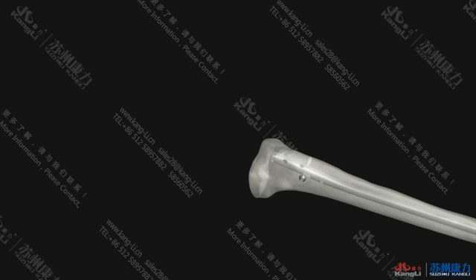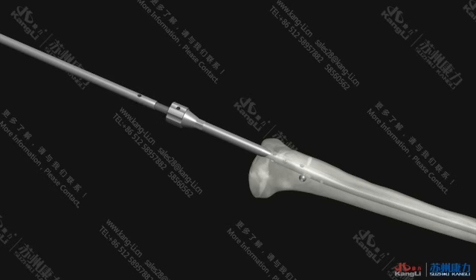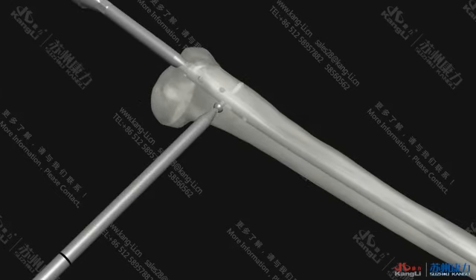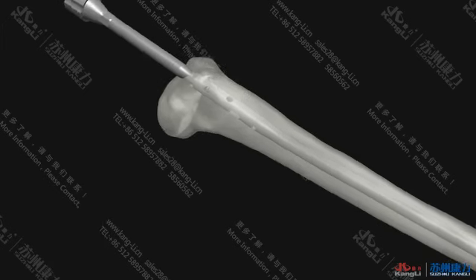Install the nail extractor on the tail end of the nail of the KTO Tibial intramedullary nailing system. Screw tight with an open-end wrench, and then connect it with the slide hammer guide bar. Remove the last locking screw left and extract the nail of the KTO Tibial intramedullary nailing system with the slide hammer.